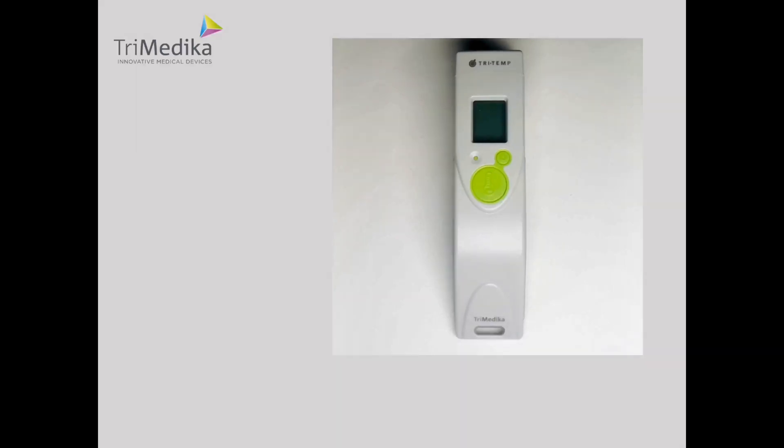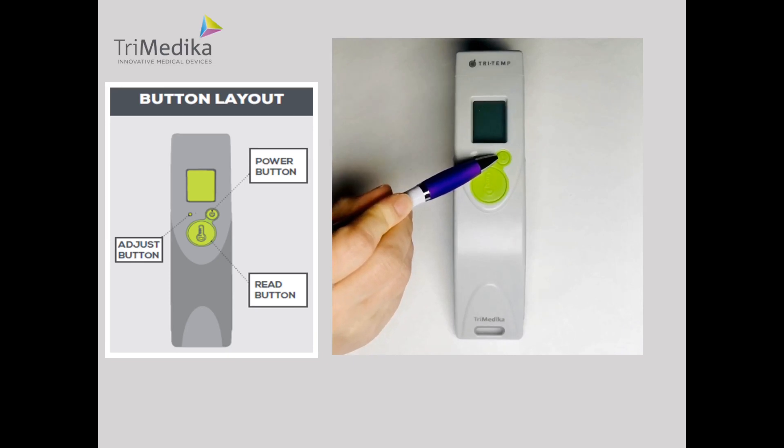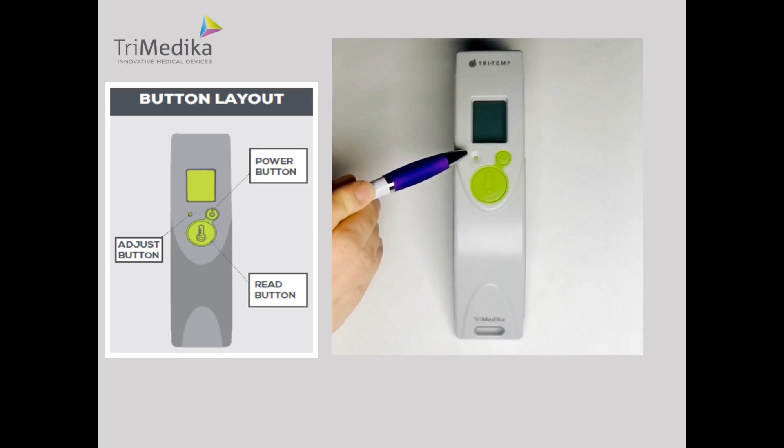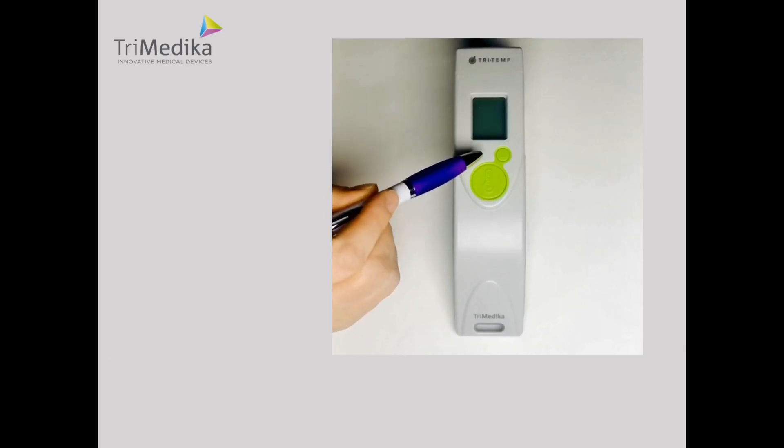Let's have a look at the buttons. There are three buttons on the thermometer: the power button, the read button and the adjust button. The adjust button can be pressed using a small pointed object such as a pen. There is no need to use the tip of the pen as this may mark the thermometer.